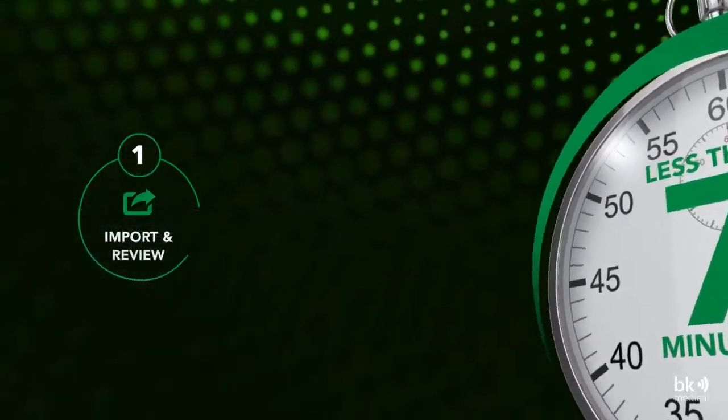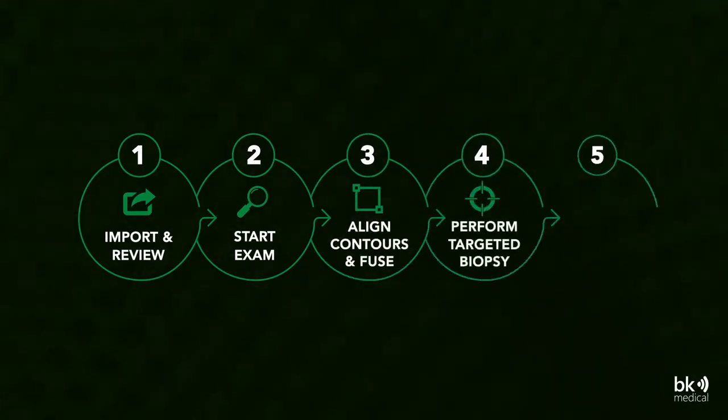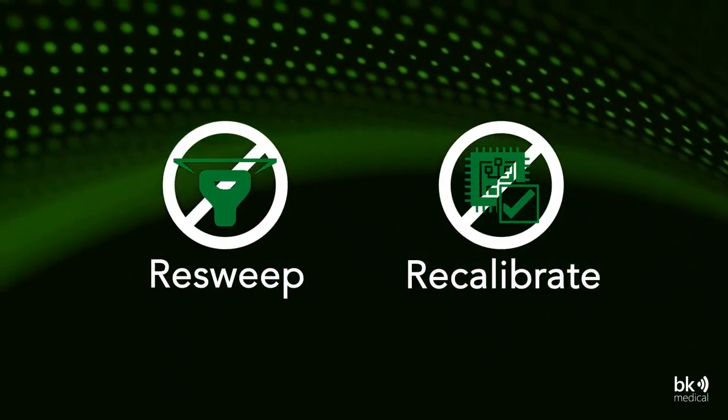BK Fusion has just 5 simple steps and offers an easy and familiar workflow for the urologist to maintain control throughout the procedure. Make adjustments along the way without the need to resweep or recalibrate the ultrasound.